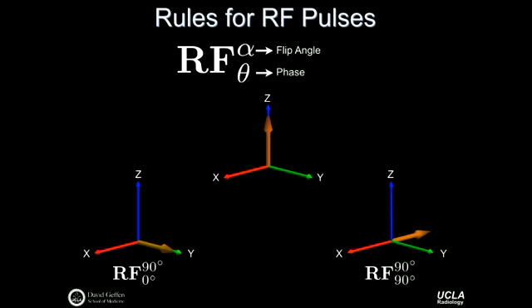Yeah. So we have to think about what B fields do, right? So think of this example here. If my phase is 0, then I said that's rotating about the x-axis. So in this example, that means my B field points along x, and it's going to rotate whatever magnetization I have that was along z down along y.